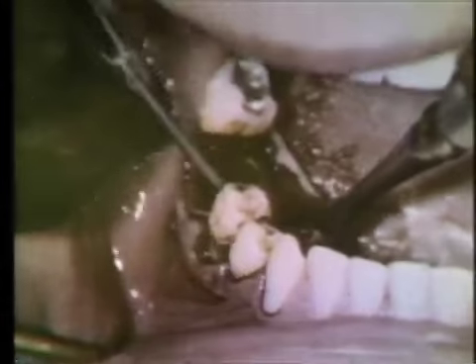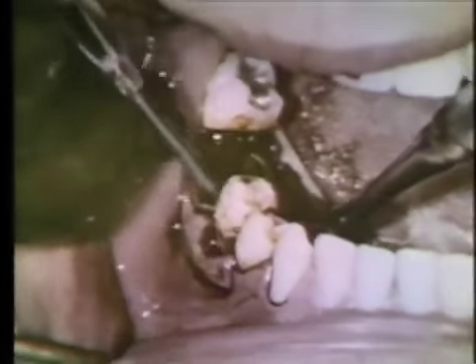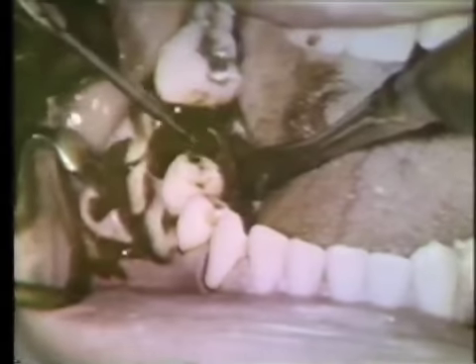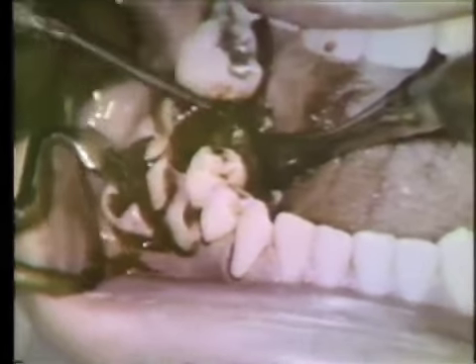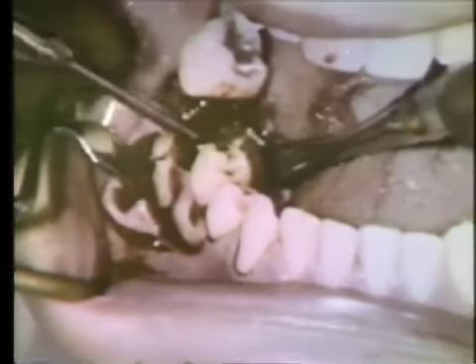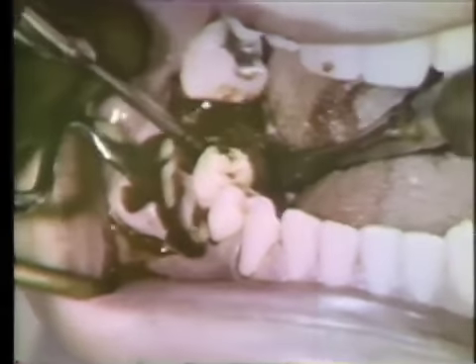These drill cuts then through bone are carried through the lingual plate, being careful to protect the periosteum as we go through. They are made parallel, and this removal is under rather low speed conditions.